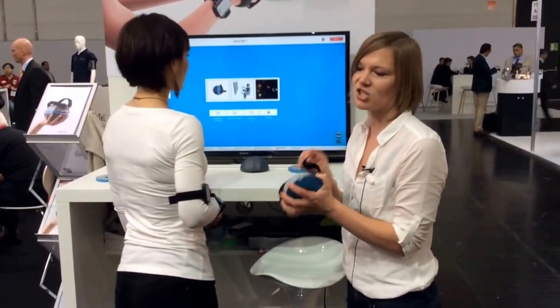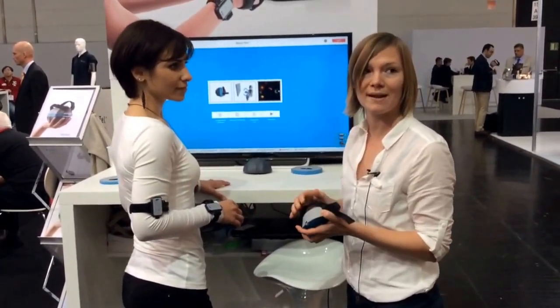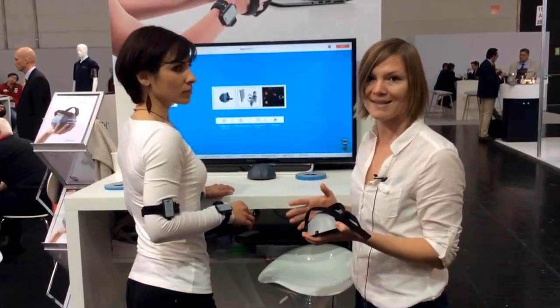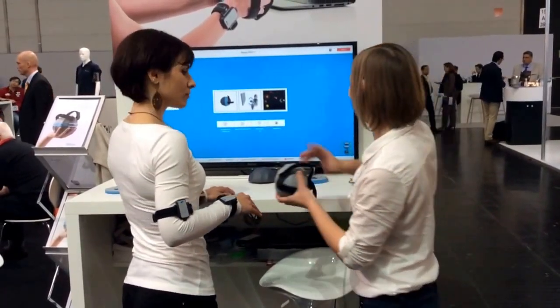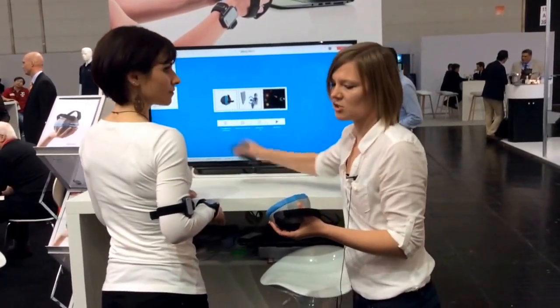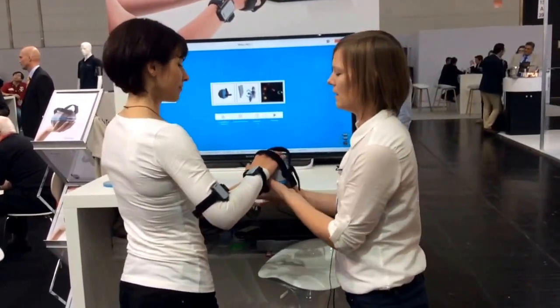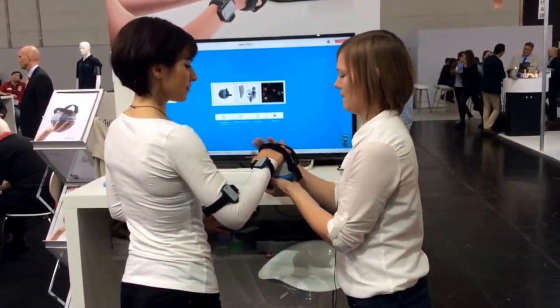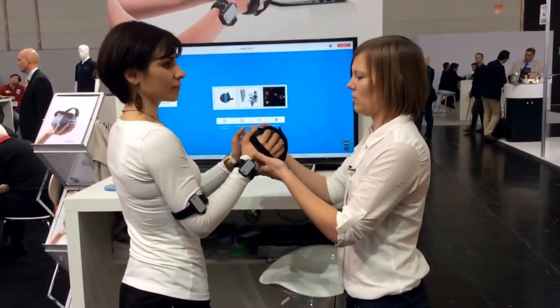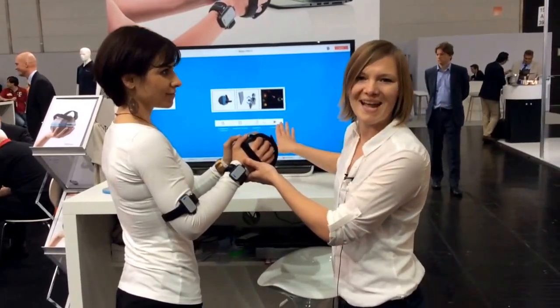The main sensor unit also has a force sensor inside, which enables us to measure the interaction between the more and less affected arm during bimanual training. So we'll try bimanual training now. The attachment and detachment of the applicables is very easy. The patient holds the device with both arms and is going to play virtual reality games.